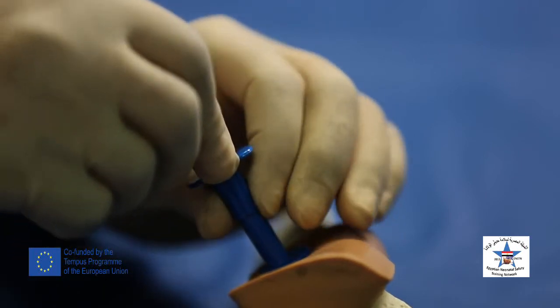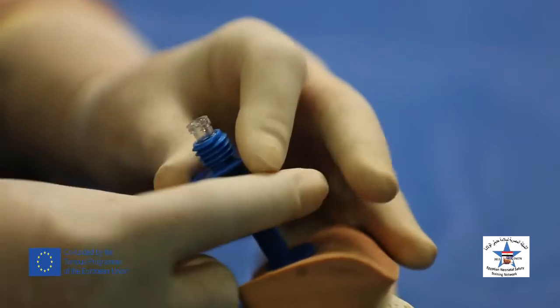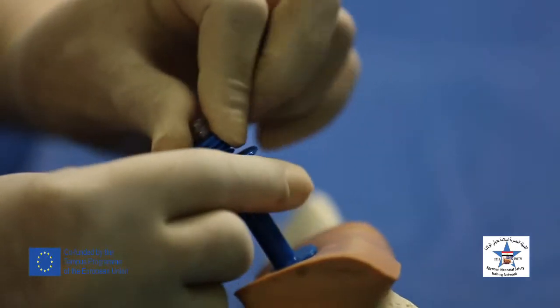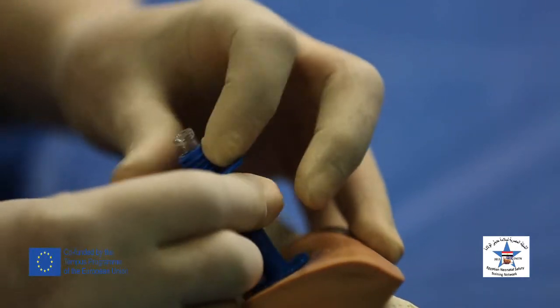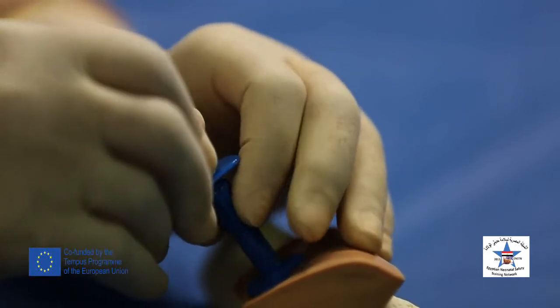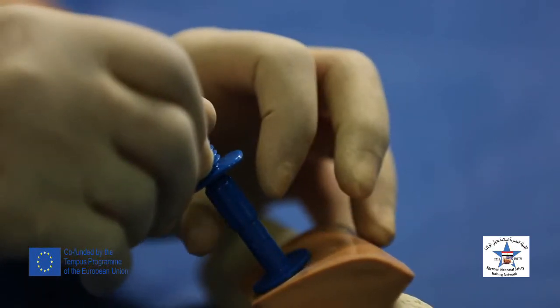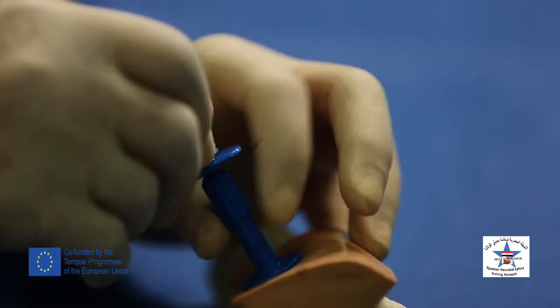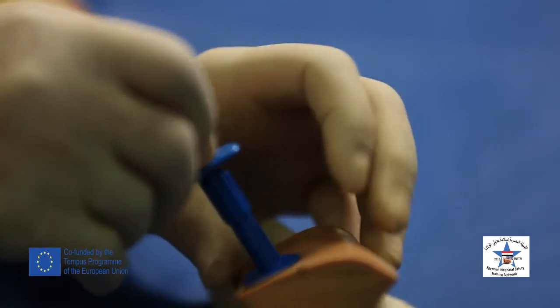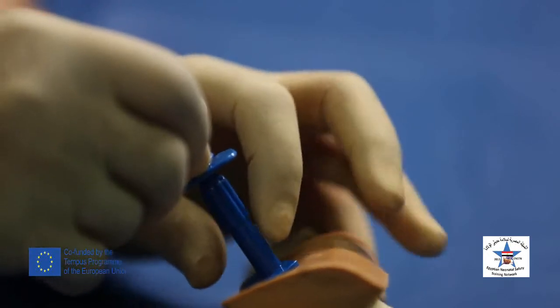If the needle has a flanging screw, then rotate the screw so that the base surface levels with the skin of the baby. This gives better support to the needle.